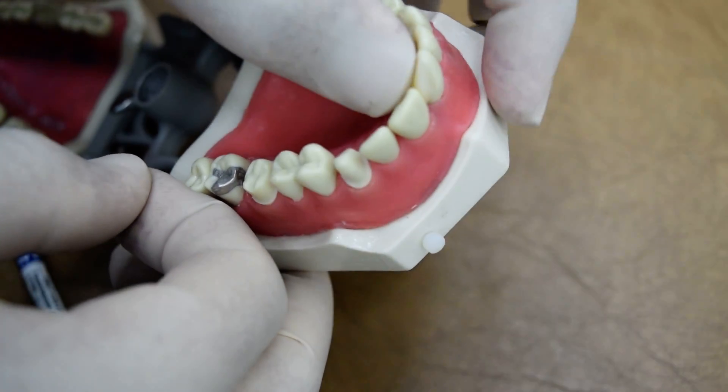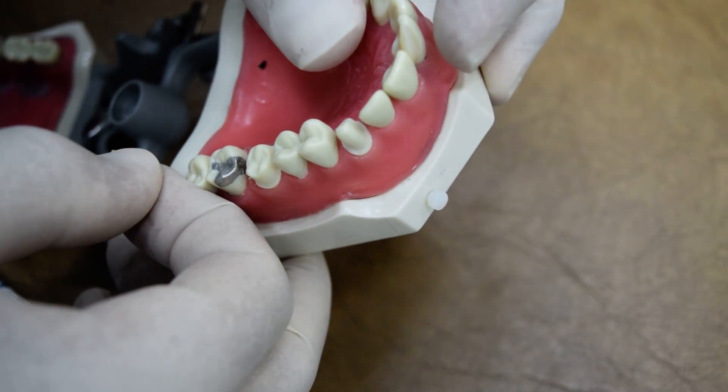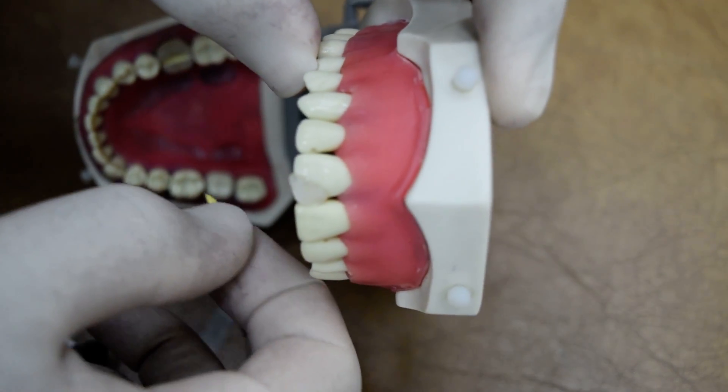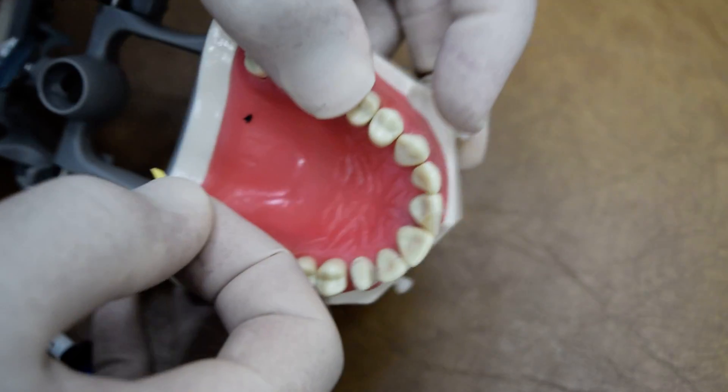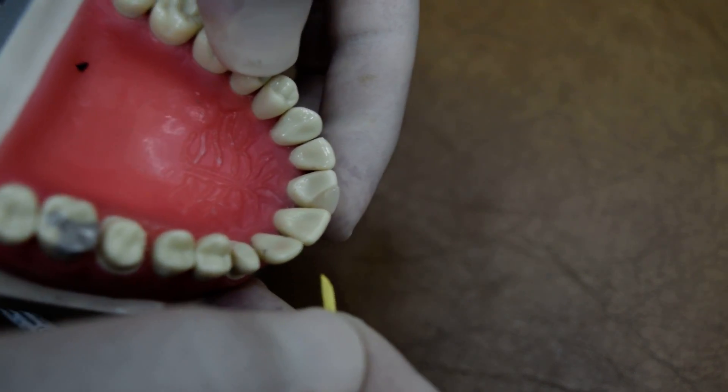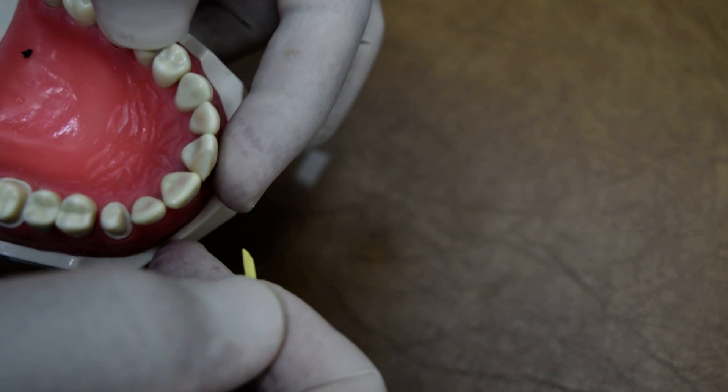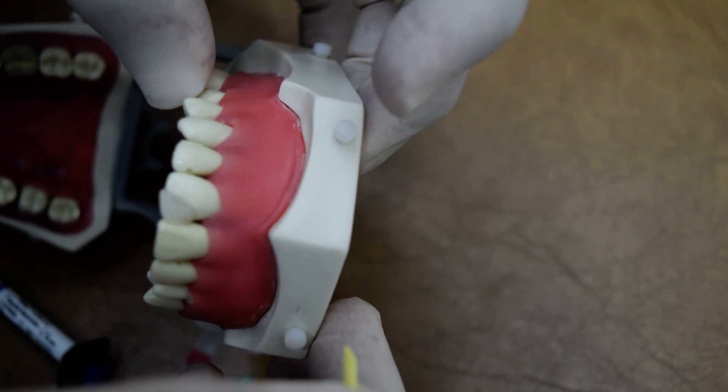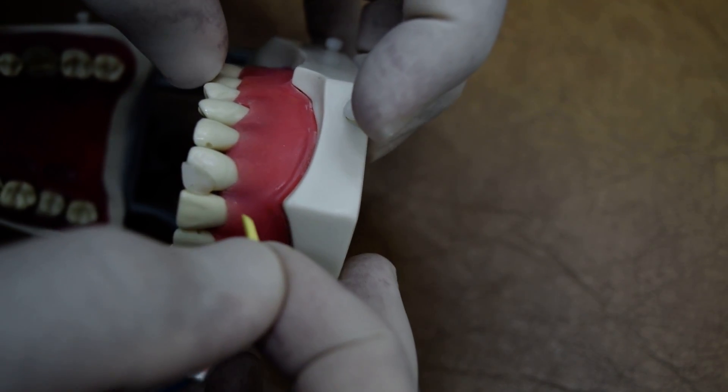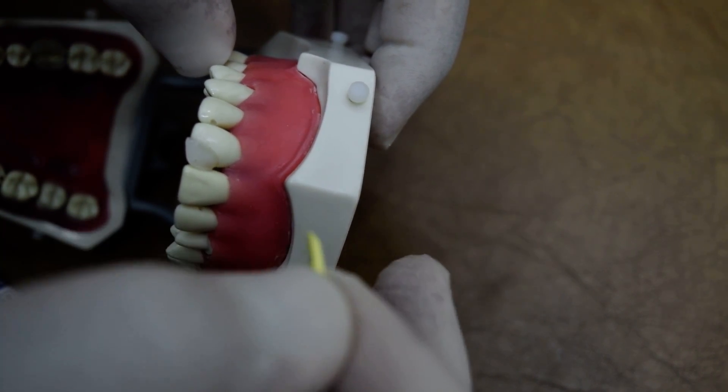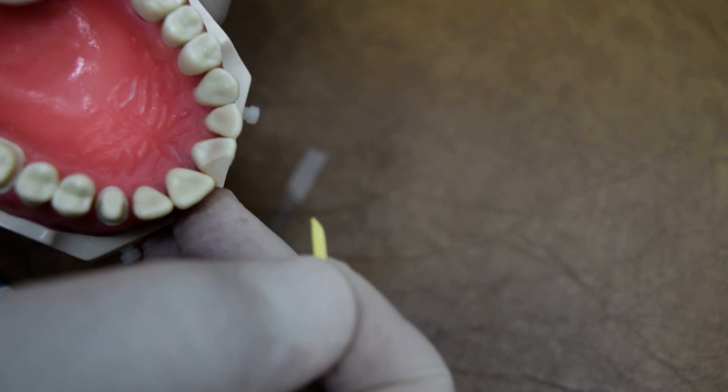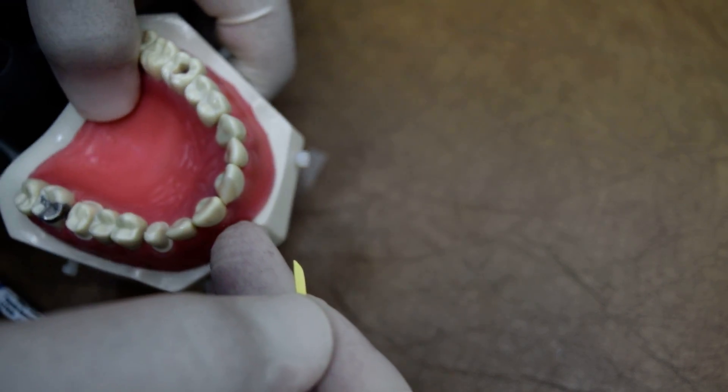I will show you a picture after doing the finishing, but this is just to show you the technique of building the composite using the flowable composite. It takes time for finishing. Finishing is very important, but the advantage of flowable composite is that it gives you a high surface polish and also it can be quickly done. The placement of the composite is not taking much time, but the finishing may take some time. Okay, thank you.